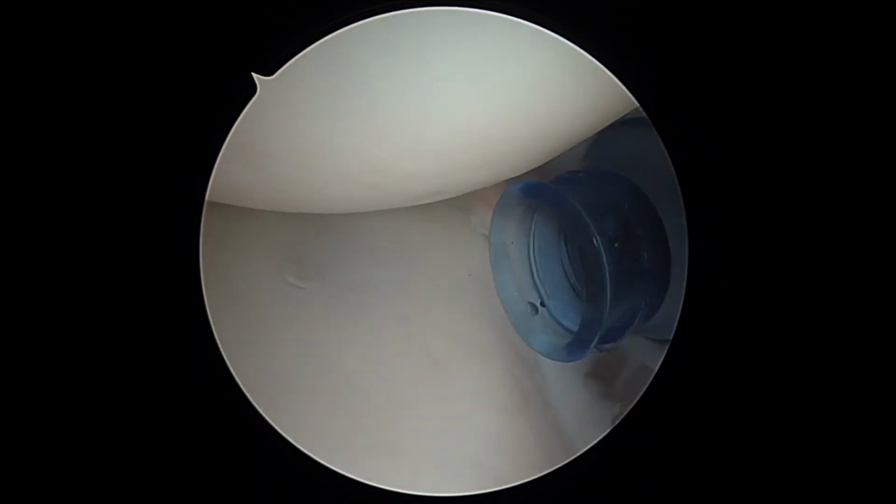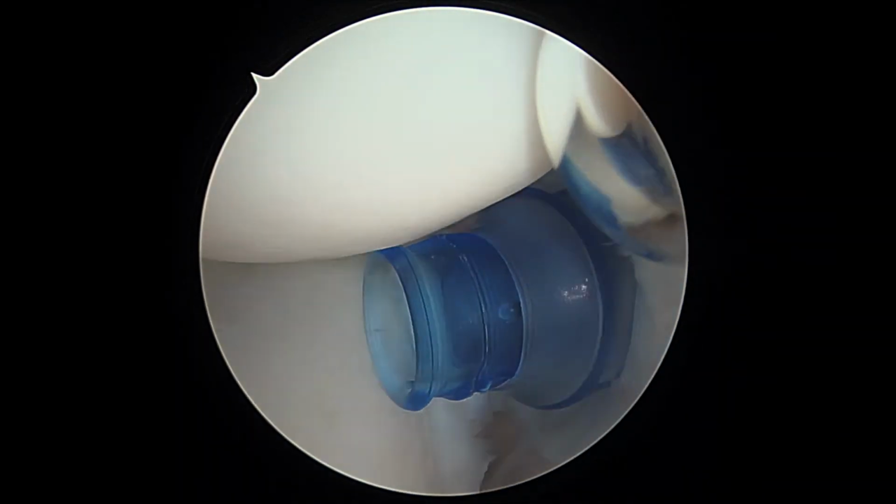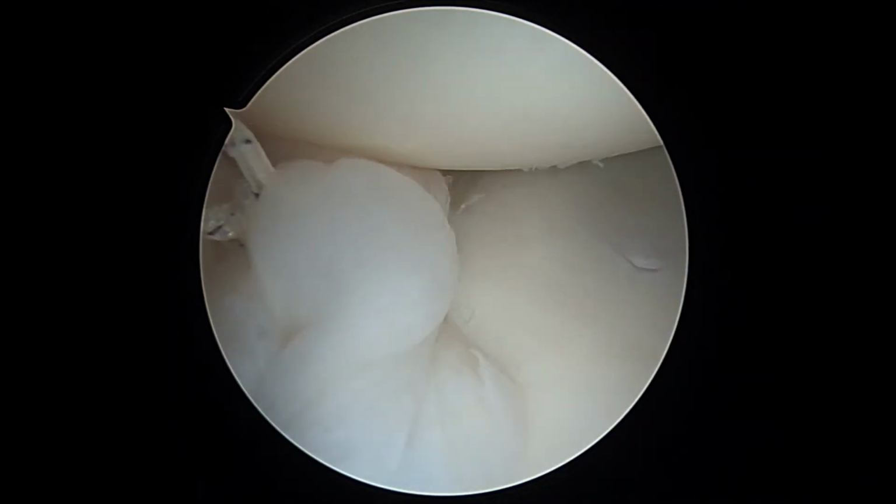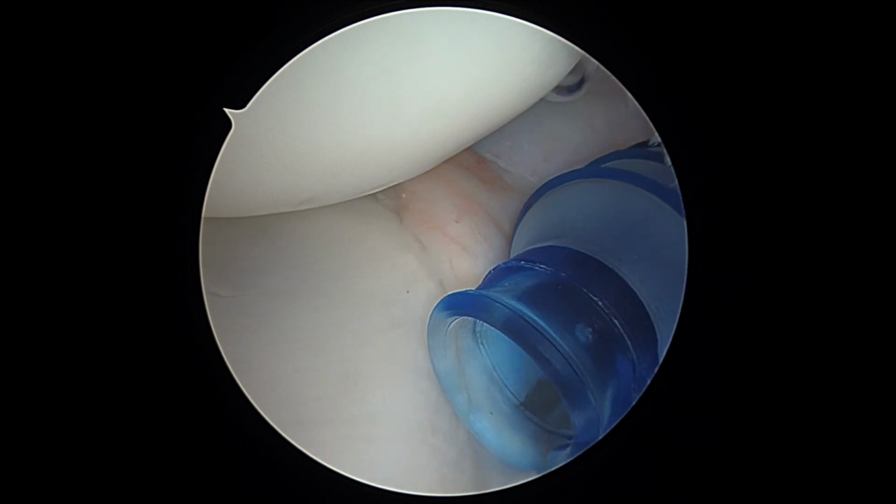Okay, so we've tied two sutures in the front, one in the back. That actually exactly matches what we did before. Your rotator cuff is fine, no significant arthritis like we talked about. And as you look at the shoulder now, it is not only balanced with the humeral head centered over the glenoid, but it looks a lot tighter if you go back and compare to the beginning of your video. So we're going to finish up here and get you back to the recovery room shortly.